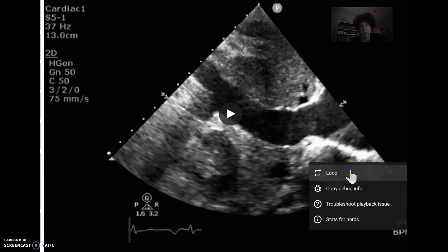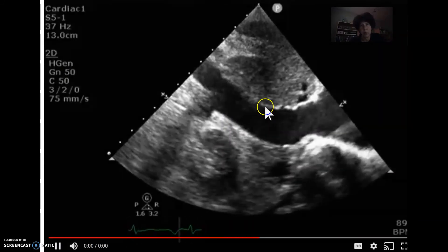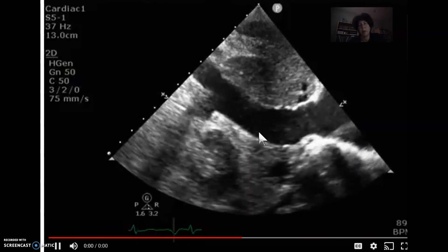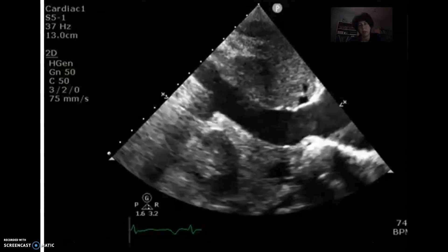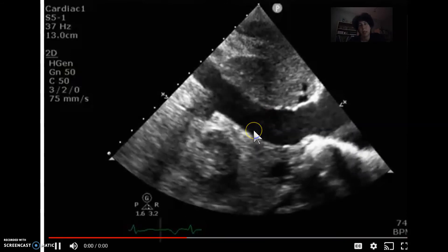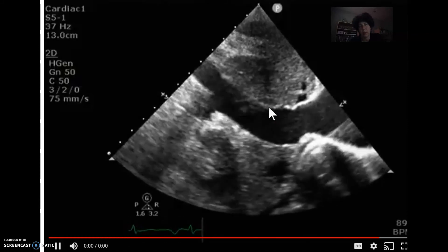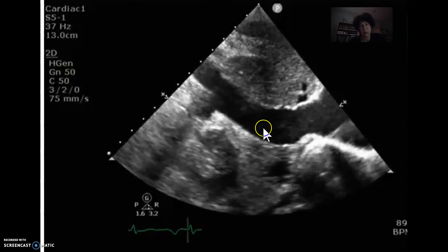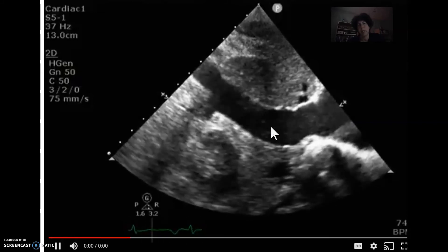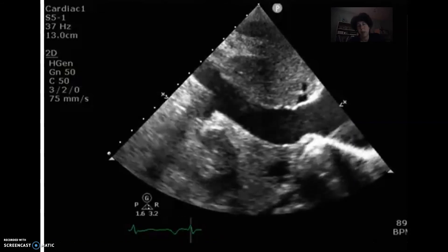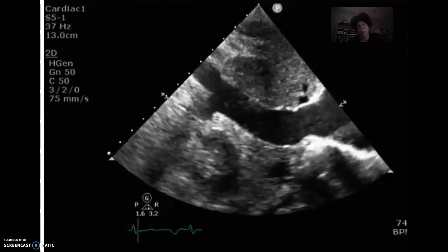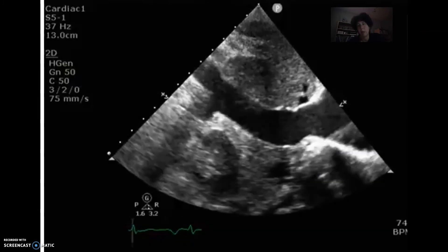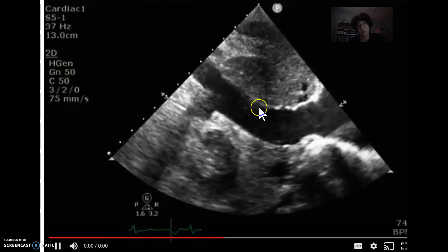Here's our IVC view. We're going to look at the total diameter and the amount of collapse — what does that tell us? In a patient with a normal heart who is spontaneously breathing, the diameter of the IVC and the amount of collapse can tell us a lot about the fluid status of the patient. Here it probably tells us more about the RV pathology and the fact that the RV is not contracting well. It's a sign you can use in your patient — if you can't see the RV and your LV is underfilled, we're always worried about a possible embolic event. If you see an IVC like this with a very small hyperdynamic LV, you really have to be concerned about RV dysfunction. That's the reason to be cautious with giving volume.